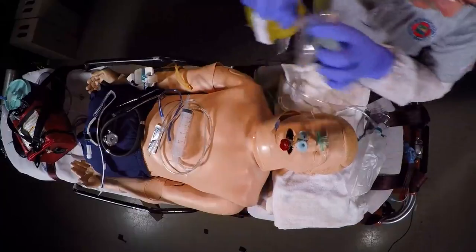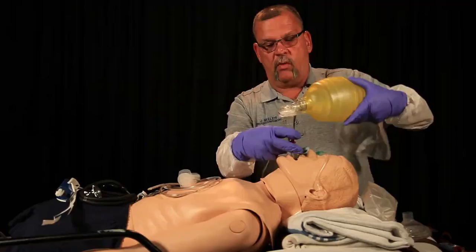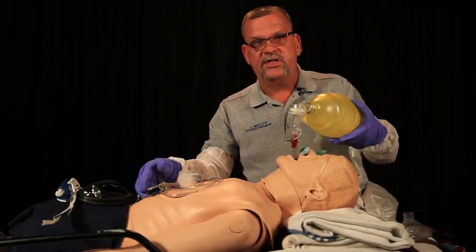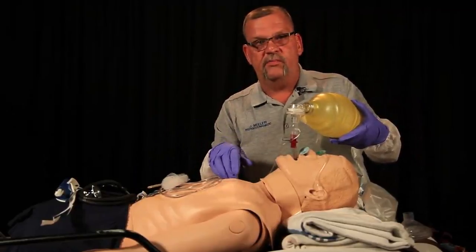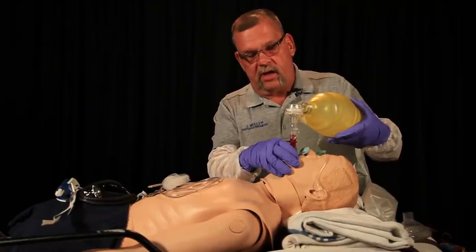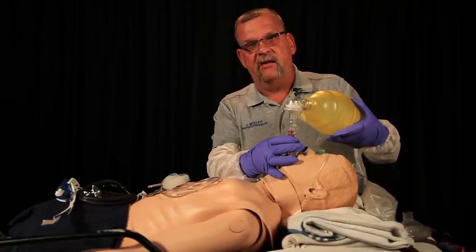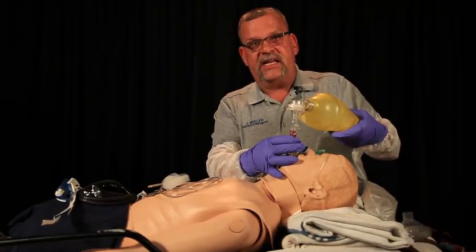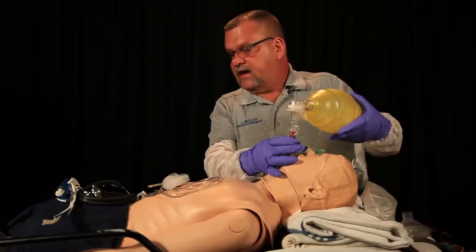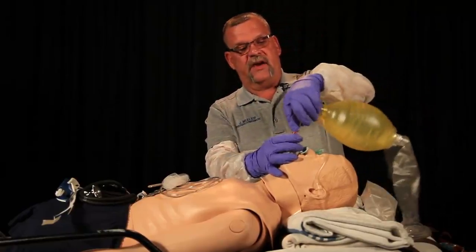We would go ahead then connect our ambu bag with our capnography to our King airway device and administer a breath. We would listen to gastric sounds first, and then we would listen to breath sounds after that. If we do meet resistance while attempting to ventilate this patient, what we can do is withdraw the King airway slightly and see if that assists the air in going in through the device. We also want to then secure the King device.